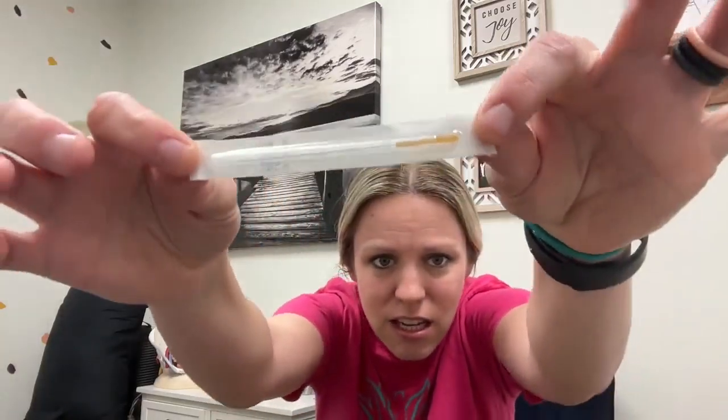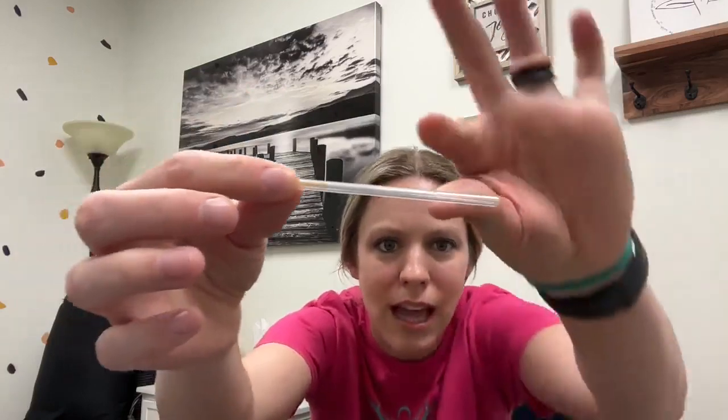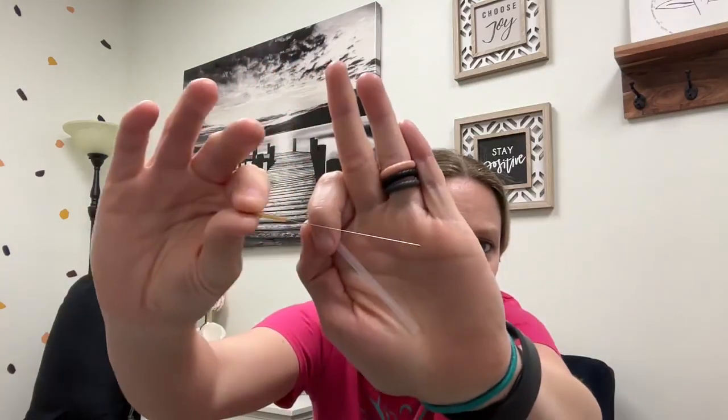It comes in this little plastic sheath, and you can see the end sticking out. I'm going to break the seal, and then that is the needle. You can see it's super thin. What we do is, see if I can do this in the camera. So I've got the banana. Normally I've palpated on the person, found the big angry knot, and then the plastic goes on their skin, and I tap it in and then pull that away, and you can see how the needle is in there.